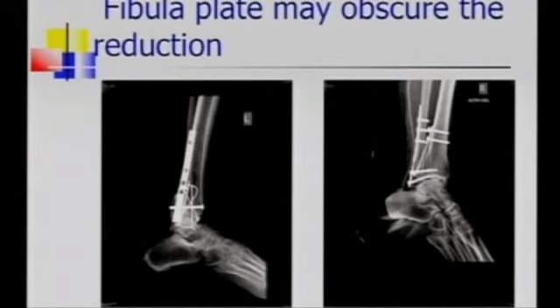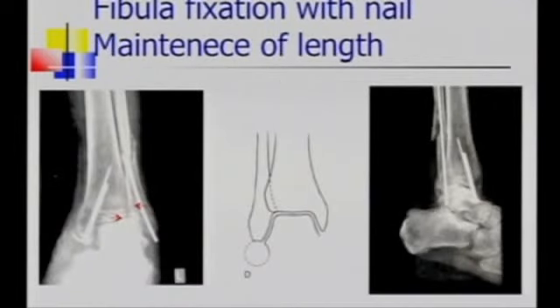Again, if I put the fibula plate first, posterior malleolus assessment is a problem. So I have fixed the posterior malleolus first. Here I have used the antiglide plate and direct access to the posterior malleolus. This is very important: the Shenton line. Once you are assessing the reduction, if you maintain this Shenton line, it is very important.